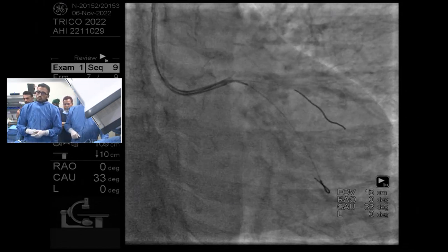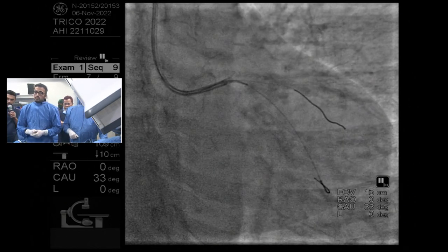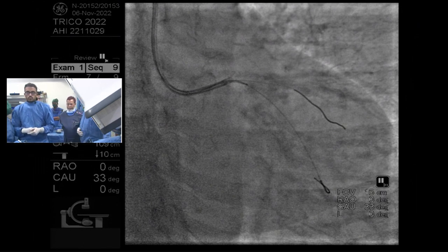Perfect. Okay? And you can see that there's diffuse bits of disease right through that, right? So what you're going to do is just make sure that you land a little distal to that marker. All right. Now come to that one. And get 2.5/32. Perfect. Just beyond the. So yeah.